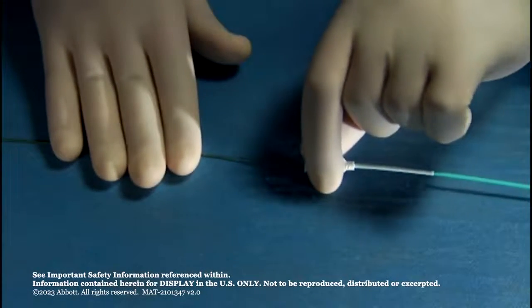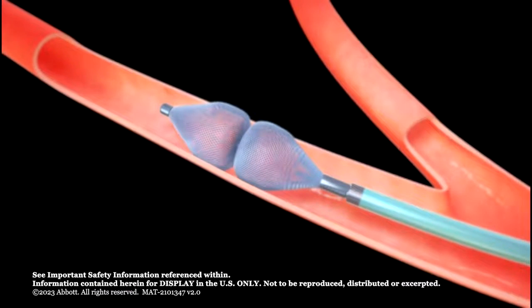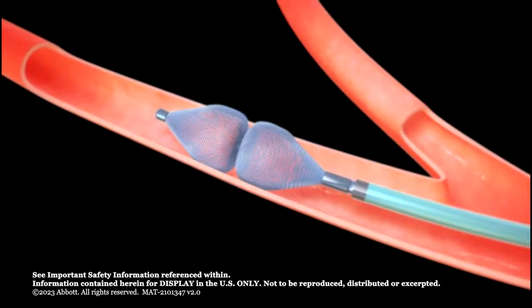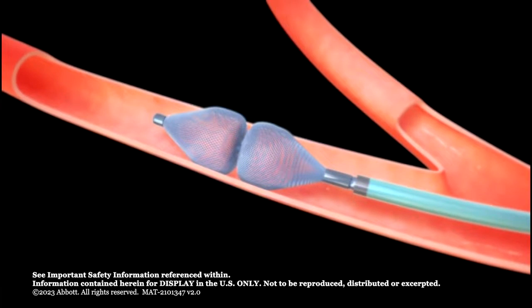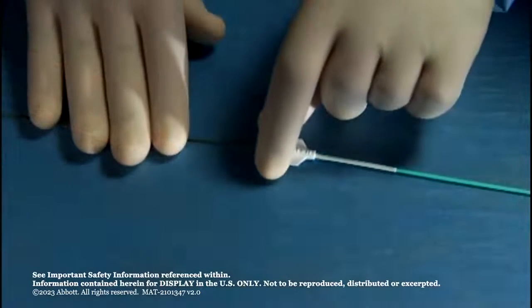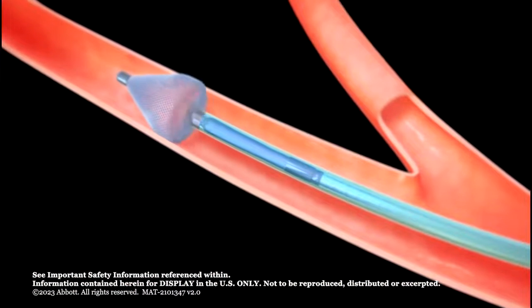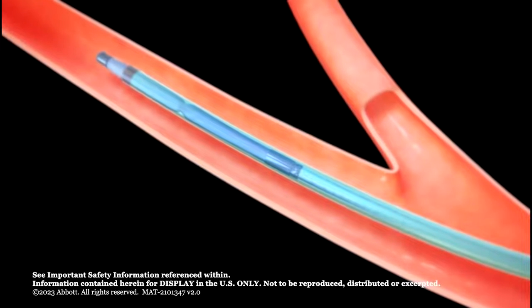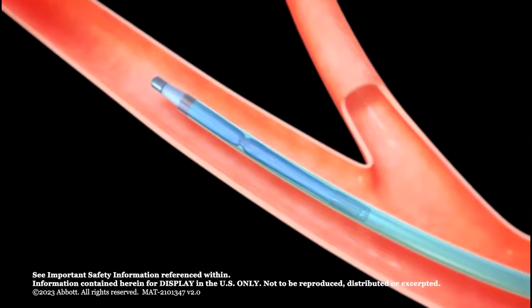Stabilize the delivery wire and gently pull back the diagnostic catheter to deploy the AVP-4 in the vessel. The device should expand to completely oppose the vessel wall. Use the radiopaque markers to evaluate the position of the AVP-4. If the position is not satisfactory, recapture the AVP-4 by stabilizing the delivery wire and advancing the diagnostic catheter back over the device until the device is at least partially within the catheter. Reposition and redeploy.